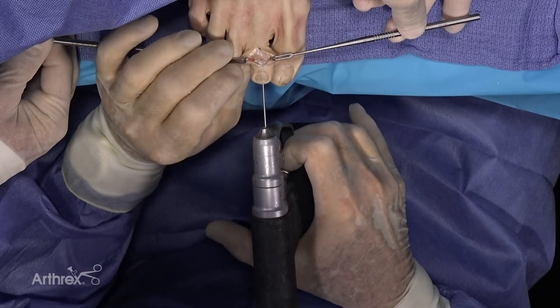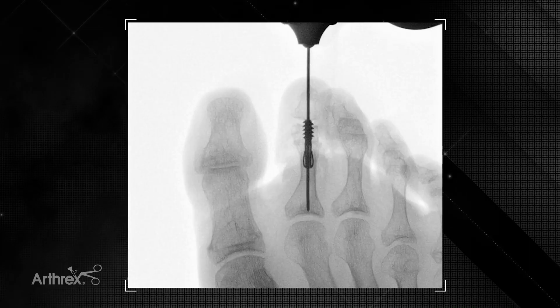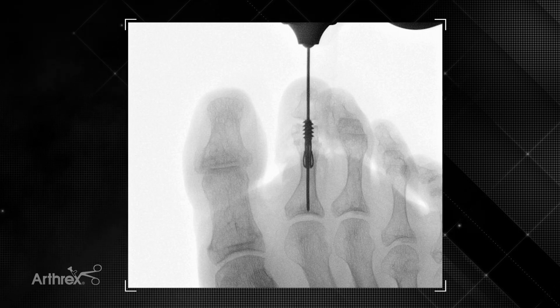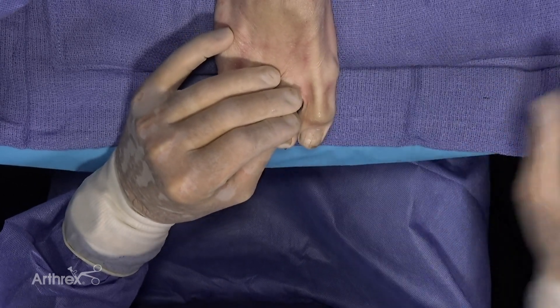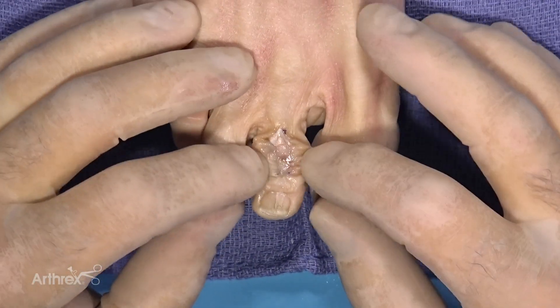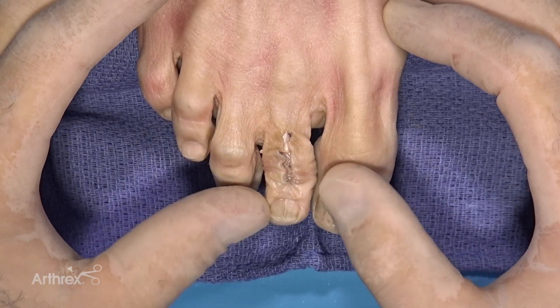You don't need to use the K-wire, but I prefer belt and suspenders and tend to use this stainless steel K-wire. On x-ray we see the intramedullary K-wire through the center of the implant. A nice feature of this cannulated device is that you can go across the MTP joint at the surgeon's discretion to stabilize that joint — very few implants allow this. I use the toe tamp to bend the K-wire down, cut the prominent part, close with an interrupted suture, and leave the K-wire in for only three weeks, at which point the area is solid and the K-wire can come out.